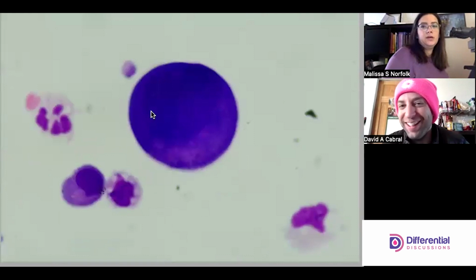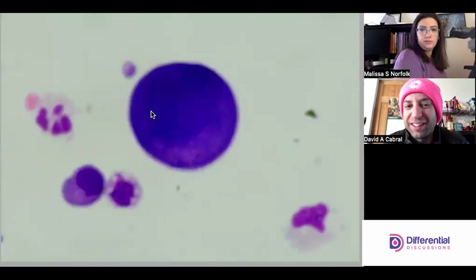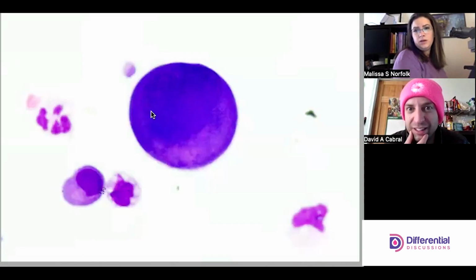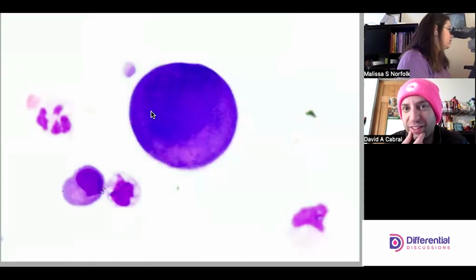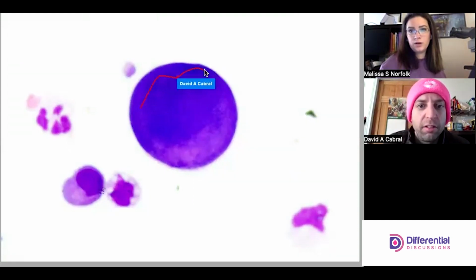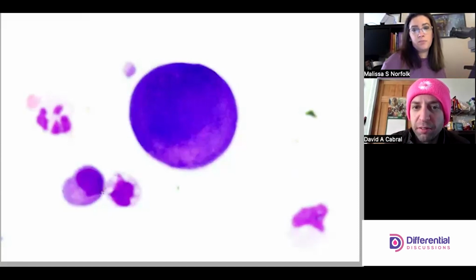Maybe if we bring the light up a little. It's binucleate. Oh, I can actually start to see the outline here. There's one here and there's one here. This is not part of the nucleus, but it's a darker area. So in scope, this looks a little better. It doesn't look quite as menacing, but it still is something that I would question and probably send to path.